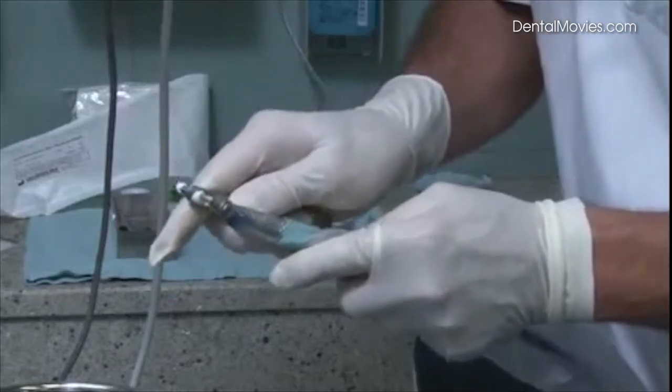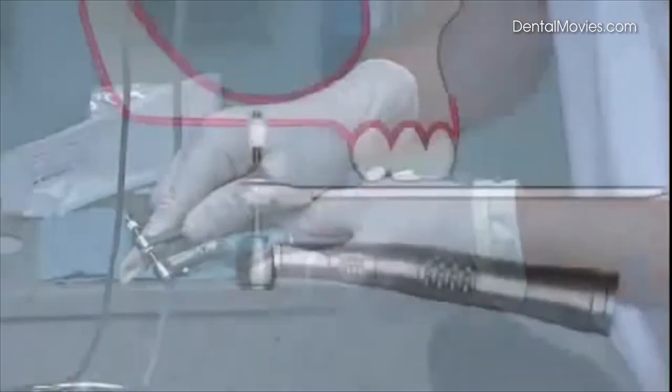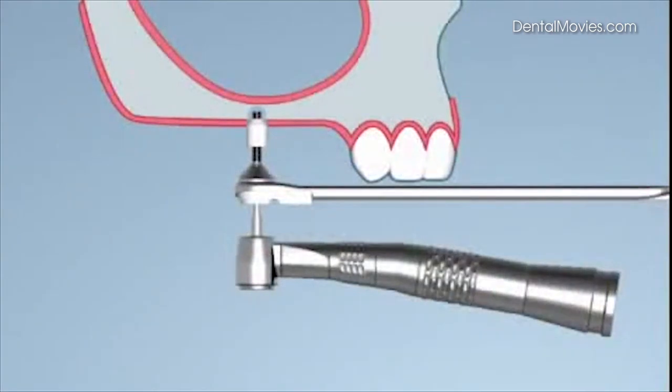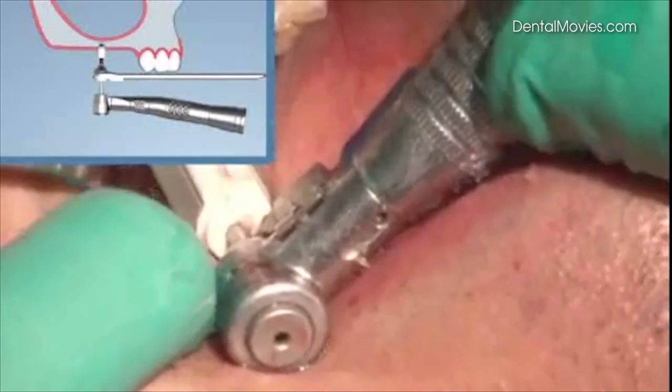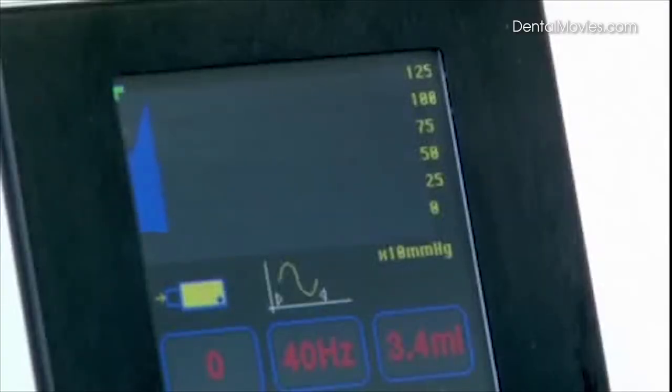The Yader drill is filled with physiological saline solution and fitted pressure-tight into the bore. The pressure is built up to 1.5 bar using the foot pedal, but each step on the pedal only injects 0.2 milliliters.